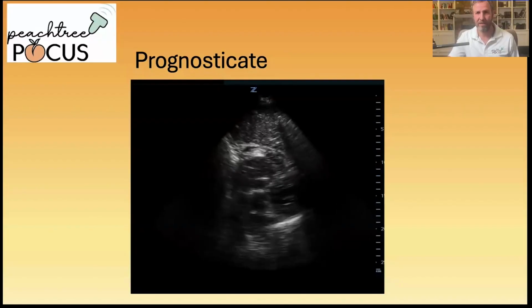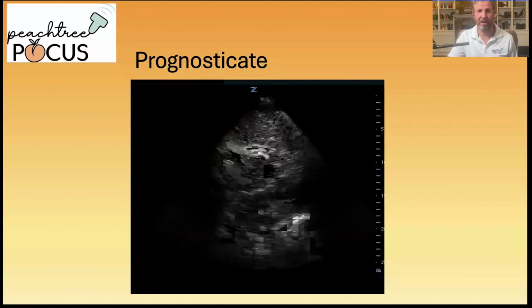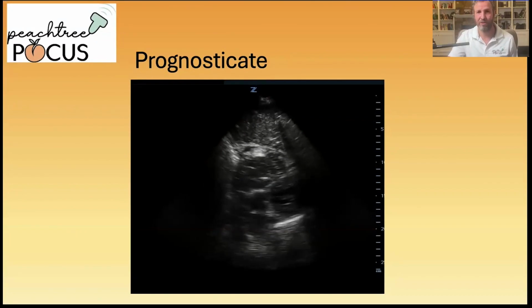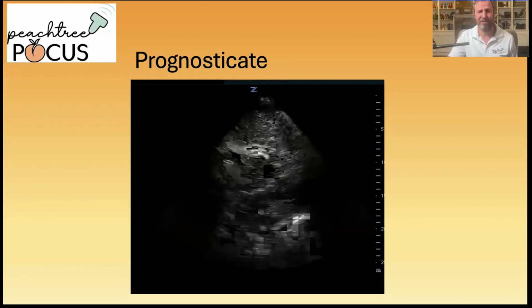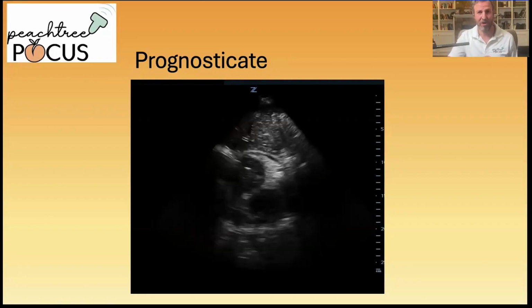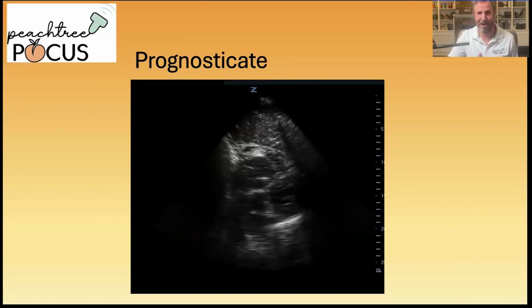Now, as you see this, the odds of a good outcome drop dramatically. Patients with absent cardiac activity are much less likely to achieve ROSC and survive to discharge neurologically intact, which of course is the real outcome we care about. Early studies in the 2000s even suggested that if you saw no cardiac activity, you could stop resuscitation altogether. But if you think about it, that actually creates a problem. If you always stop resuscitation when the heart looks still, of course nobody survives. It becomes like a self-fulfilling prophecy.